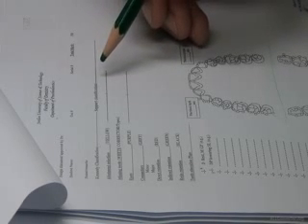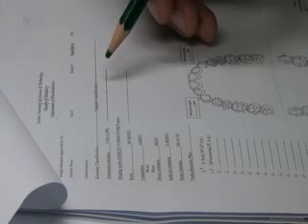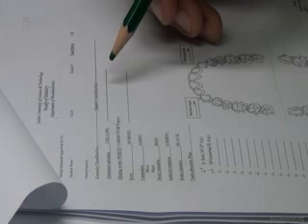Okay. For any cast you get, you should fill in the Kennedy classification, as well as the support classification. Because even when the Kennedy classification is a class 3, for example, okay, class 3 will not tell you what is the number of teeth missing. So if it's an extended bounded saddle, the type of support is different.